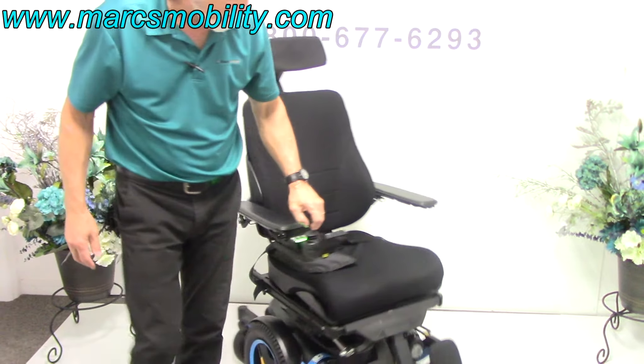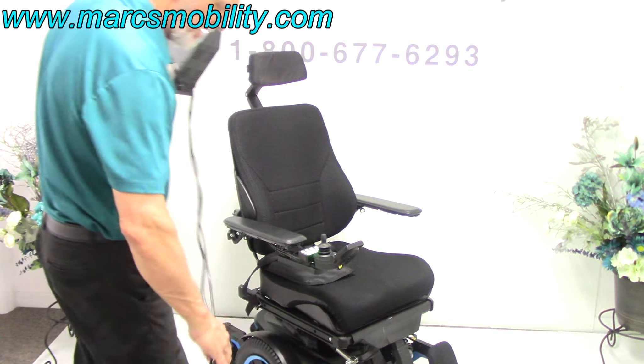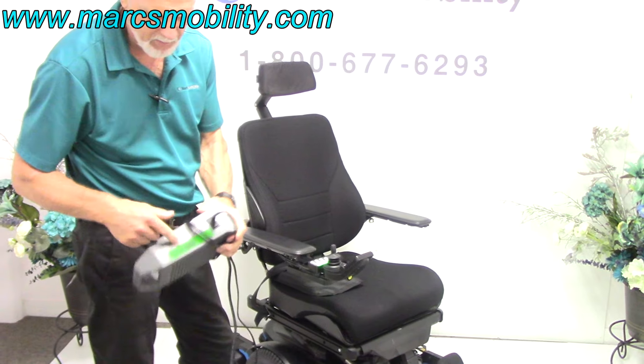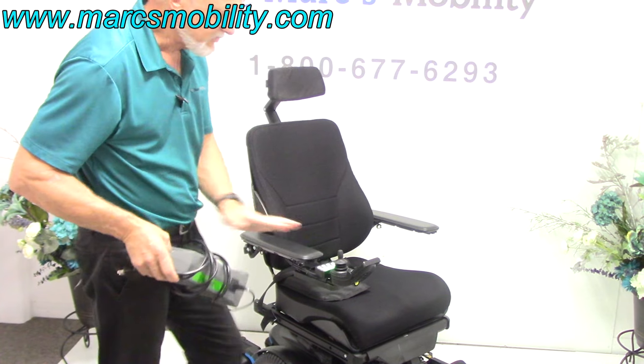When you charge the batteries in this chair, you take your Permobil charger and plug it right below the joystick. As soon as the light goes to full on your Permobil charger, you're fully charged. The charger will stop charging automatically.